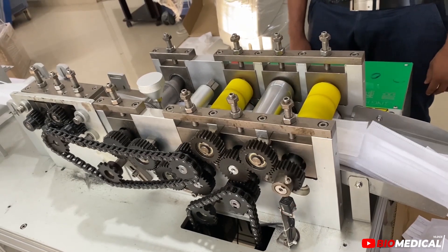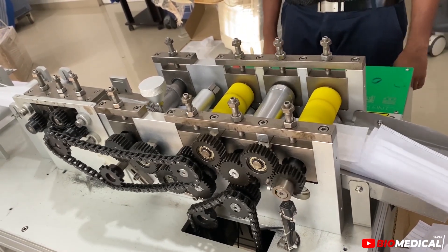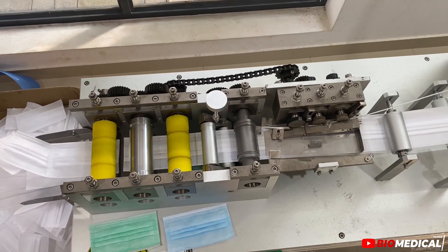The last two processes are cutting, and we will be able to get the output from the mask.